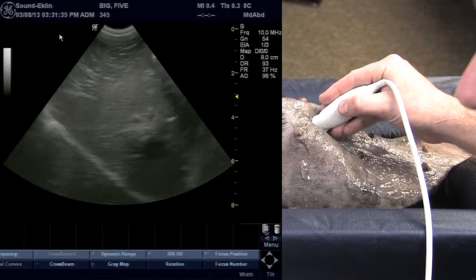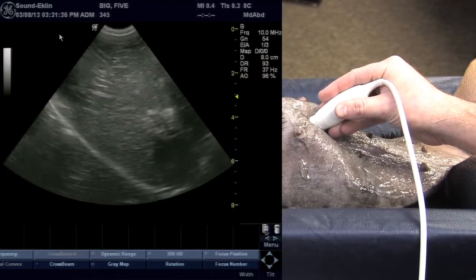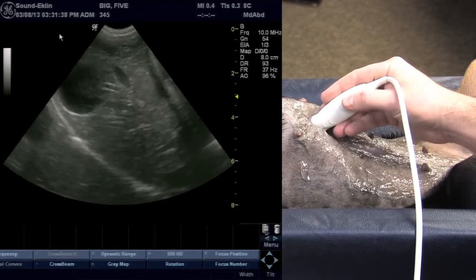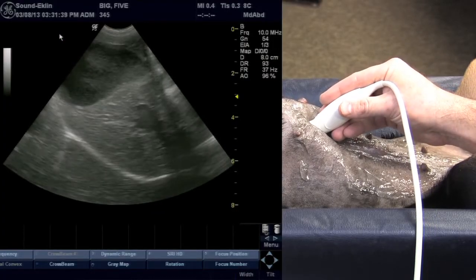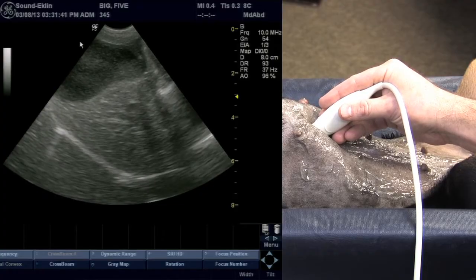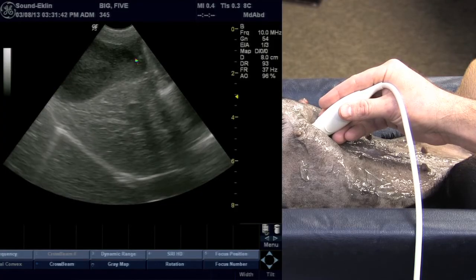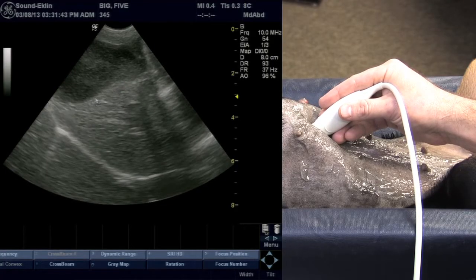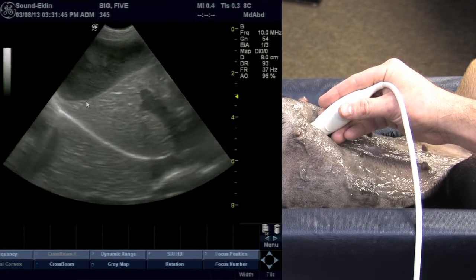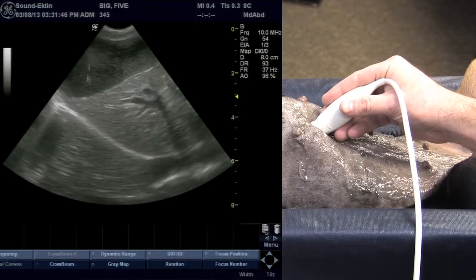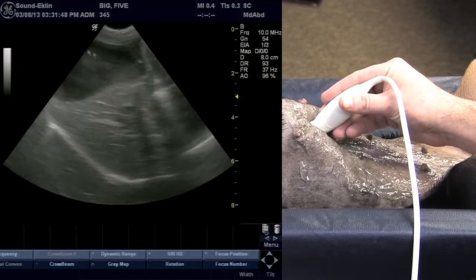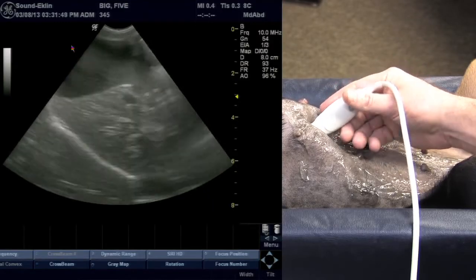As we start at the midline and I sweep just towards the right — this would be the dog's right — we'll see that the gallbladder comes into the field of view. This is our gallbladder here; it has a nice thin wall, less than two millimeters. We can see where we have sludge in the lumen of that gallbladder.